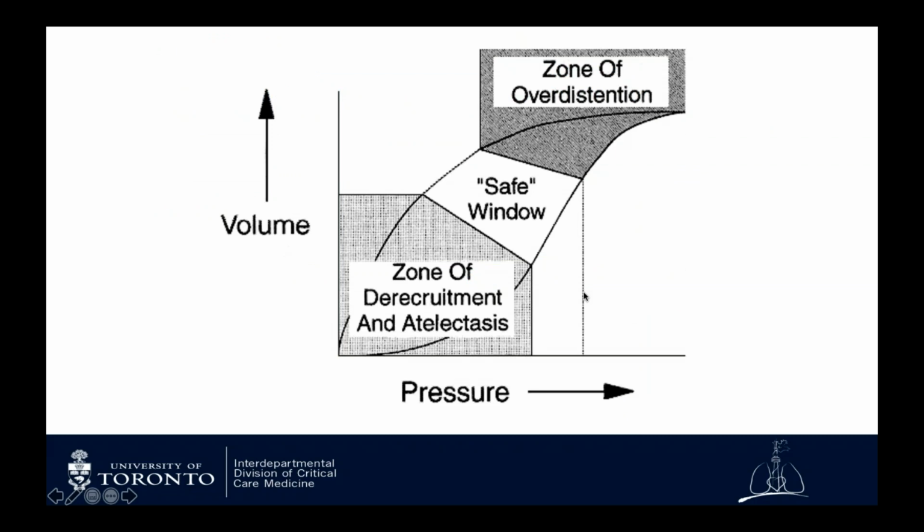I think it's important to keep this kind of schematic in your head when you're thinking about lung protective ventilation. This is the volume-pressure curve of the lung, inspiration and expiration, with a fair amount of hysteresis in this example. We want to avoid this zone of overdistension, which we know causes ventilator-induced lung injury. And setting the right PEEP helps us, as depicted here, largely avoid a zone of derecruitment and atelectasis, but the truth is these two things are tied together. The more derecruitment and atelectasis we have, the more the remaining lung is at risk of overdistension, because it's fewer alveoli having to accept whatever tidal volume you're giving.